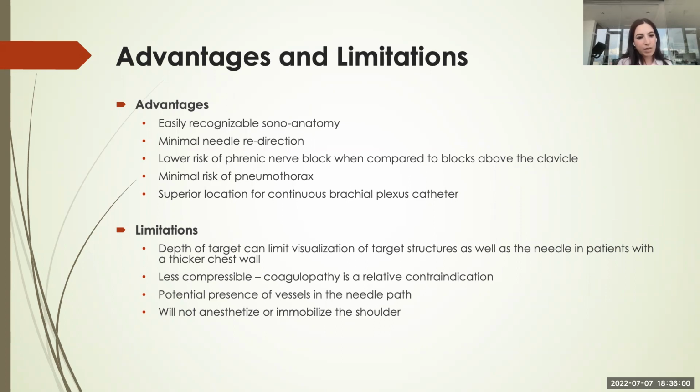And again, just with any other block, there is the potential presence of vessels in the needle path, and sometimes they're arranged in such a way that an infraclavicular approach would not be ideal, but it's important to recognize where those vessels are.